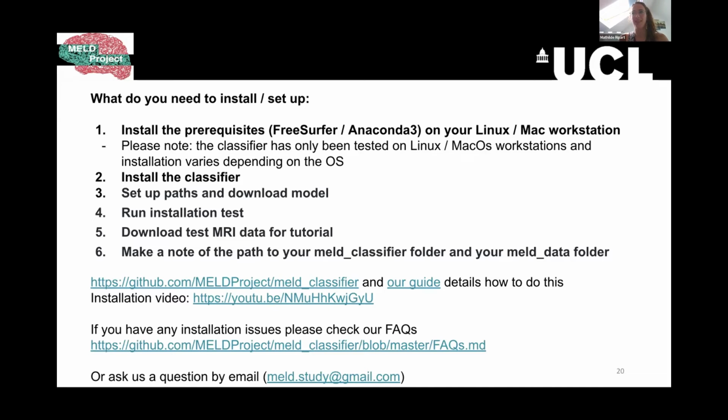And because they also have changed some code, we have not tried how robust the results are, and if it's still giving us the same results. So even if you can make the pipeline work by just changing the command, we cannot really be certain of the results because we haven't tried it.